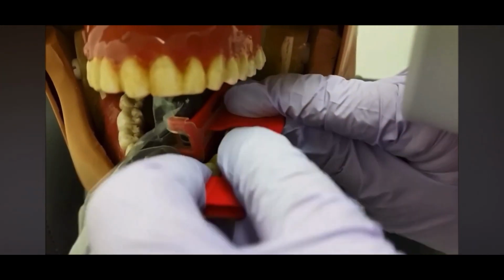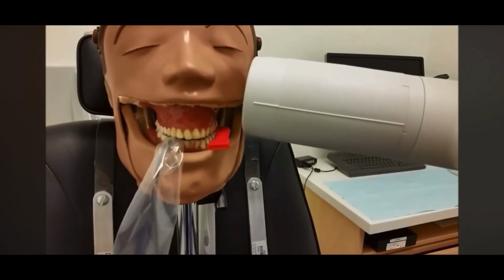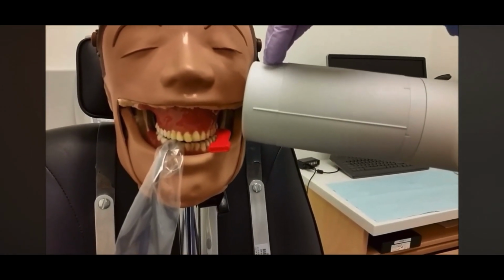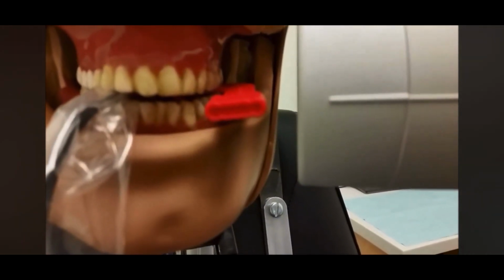And one way to try to keep your central beam going perpendicular with the sensor is you can line it up with the bite tab. That's a great way to ensure that you're right through the middle of that sensor.